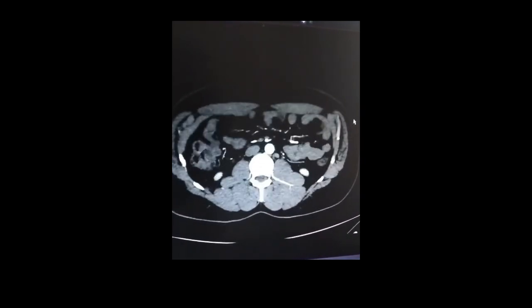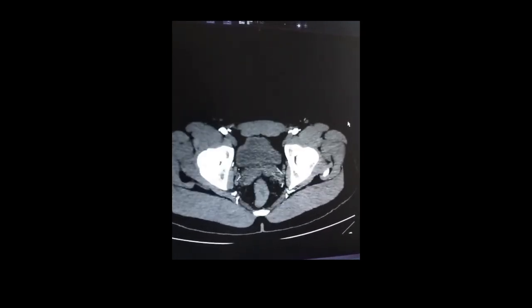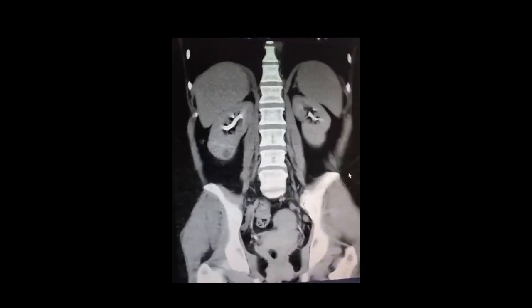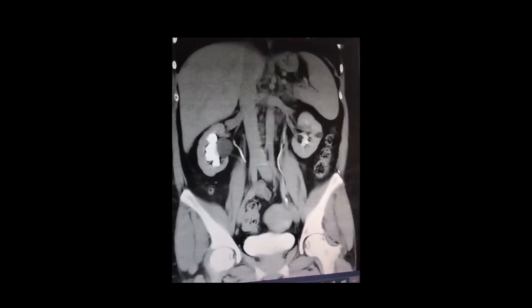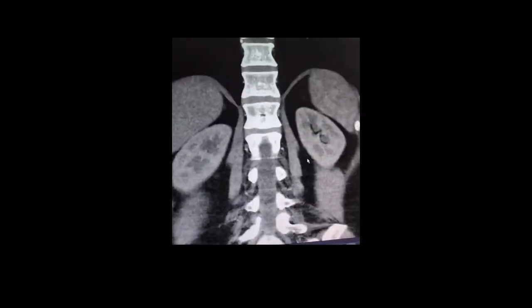8. Parenchymal pancreatic phase, 40 to 60 seconds. Description: pancreas enhancement while surrounding tissues are less enhanced. Application: detection of pancreatic tumors. 9. Enteric phase, 40 to 50 seconds. Description: intestinal lumen enhancement. Uses: detecting GI tract pathology.